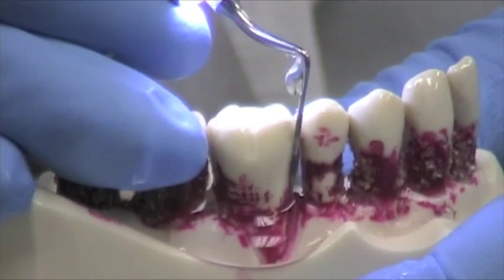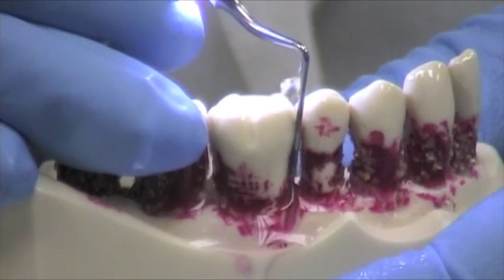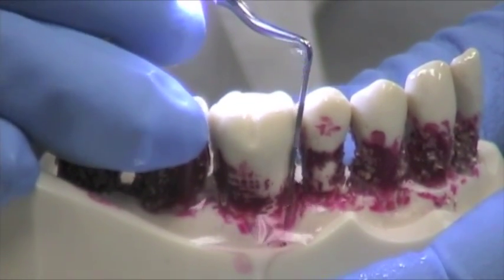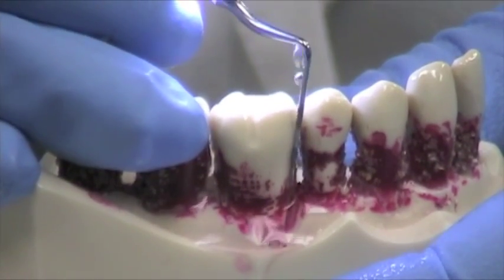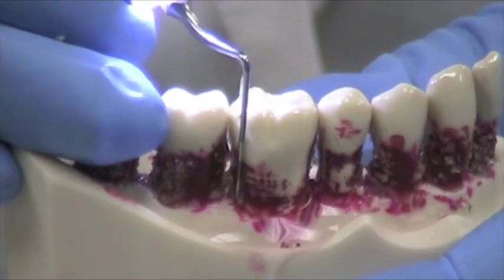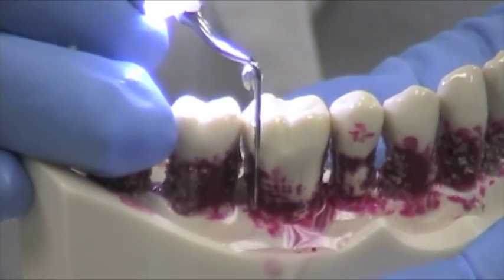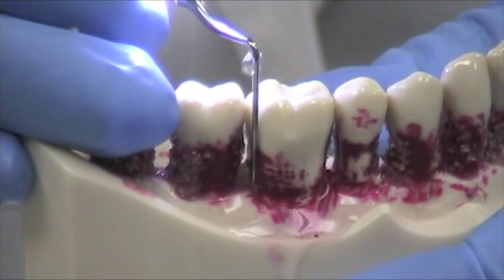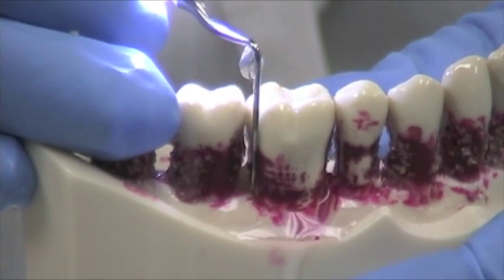I can't quite demonstrate how to go down into a pocket, but I think you can all understand. This is great when they have the demarcations on here, because then you have a rough idea — if you have a 7mm pocket — if you're getting down to the base of the pocket. There are times when there are slivers of bone loss, slivers that are just the width of a periodontal probe. This tip is great for that because you just place it down in that pocket and you don't even have to move it. Just let the technology work for you.